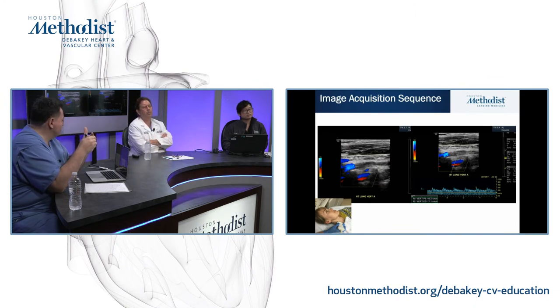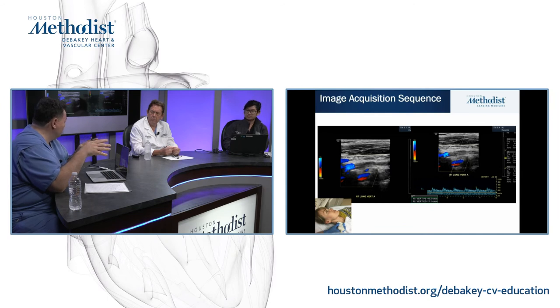This is why it's important when you have this ultrasound that you're not just finding one thing. There's direction of the flow, resistance of the vessel. There are multiple clues, so even if you're missing one clue, you have another two or three indirect pieces of evidence that you need to follow to be able to avoid those mistakes.